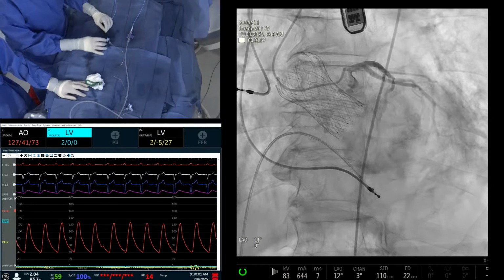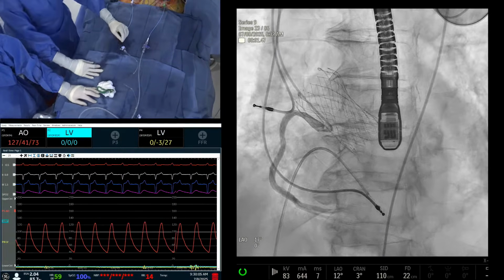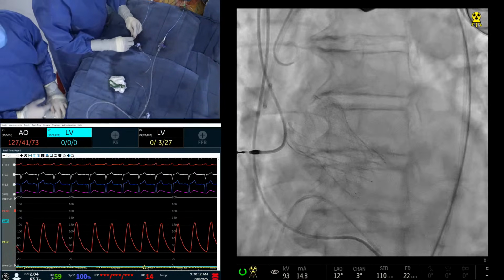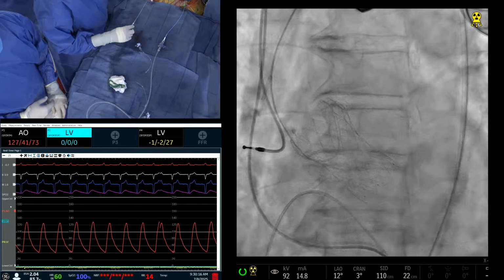Yes. When I did the circ PCI, and of course now you saw how good the engagement has been, and with the right coronary. So really FX plus worked. Yeah, FX plus worked, and this one has a really perfect alignment for commissural, confirmed on the CT scan. Okay. Tell us, AK, what you're doing now.